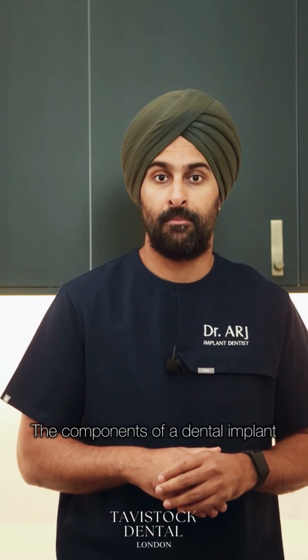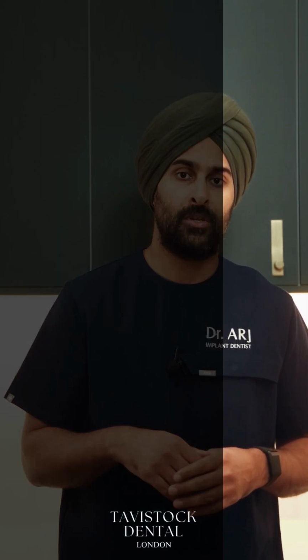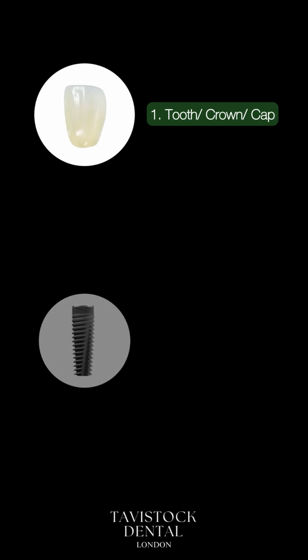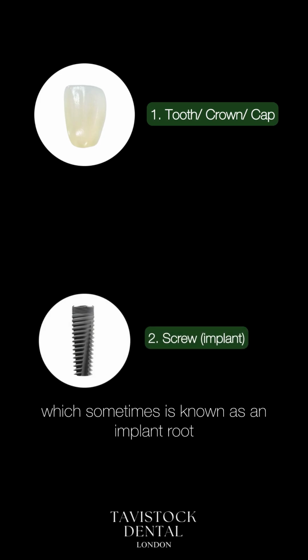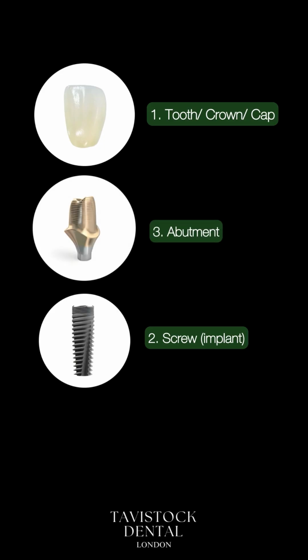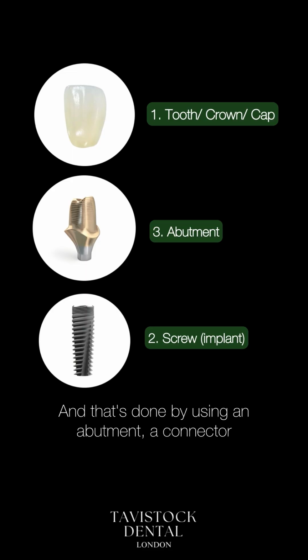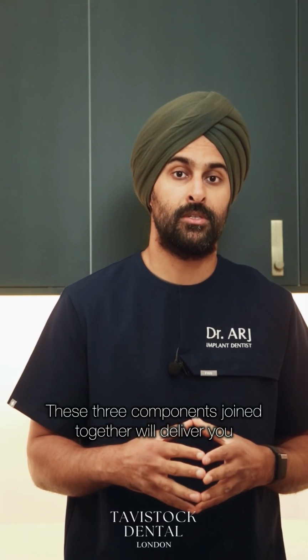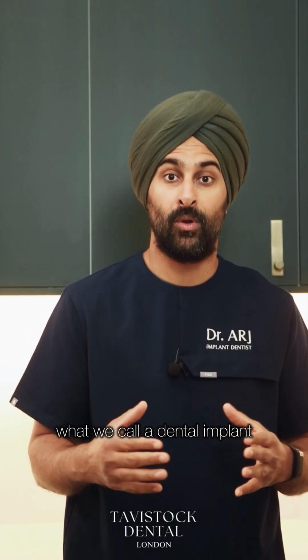The components of a dental implant, and we'll talk about a single implant to begin with, it comprises of three main parts. So you've got the tooth, the crown, which is what you're really after. That can be called a cap, a crown, or implant tooth. Then you've got the actual screw, the implant itself, which sometimes is known as an implant root. And then thirdly, you need a way of connecting the implant itself, which sits in the bone, with the crown, the tooth that you're after. And that's done by using an abutment, a connector. These three components joined together will deliver you what we call a dental implant.